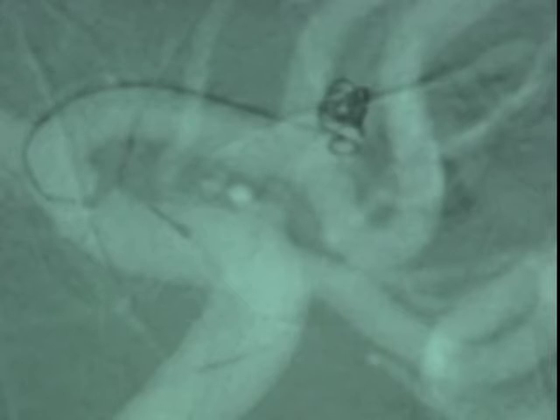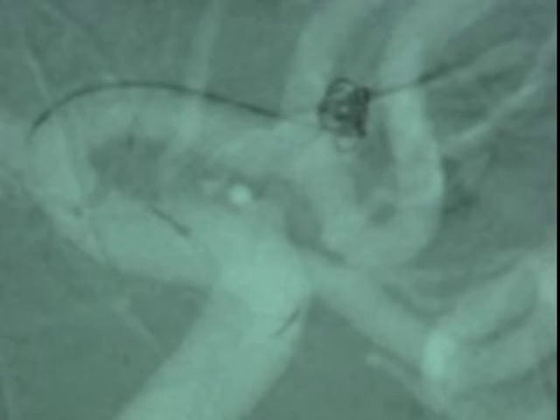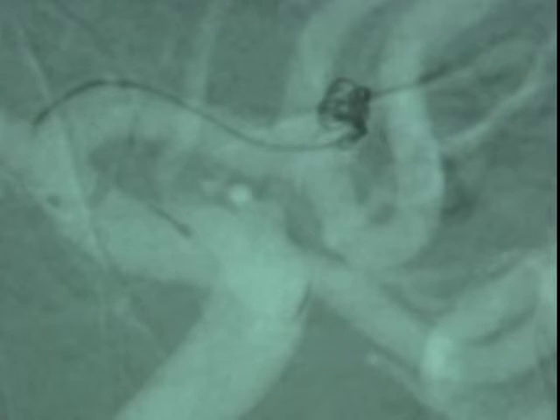You'll notice several different manipulations of the wire and catheter and coil until the coil decides to assume a position in the aneurysm where it cannot herniate out of the aneurysm into the normal vessels. The coil is withdrawn and is going to be re-advanced until we have satisfactory placement.